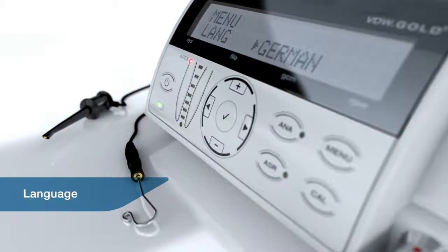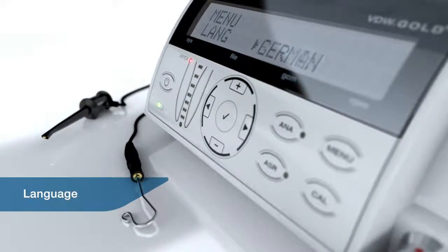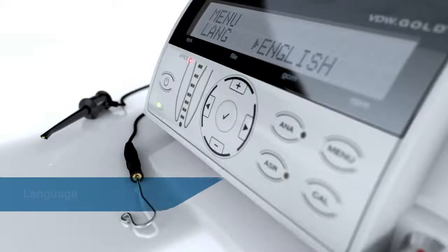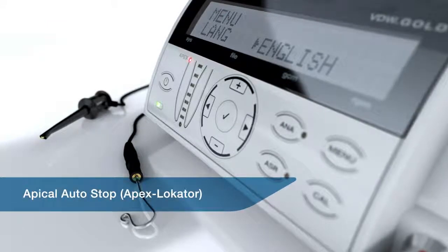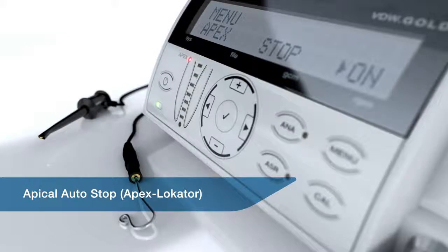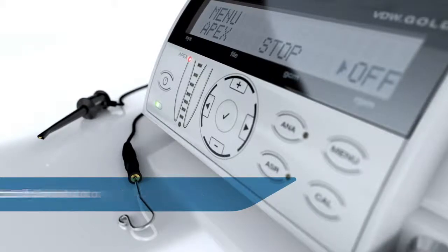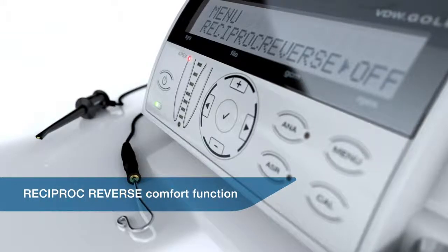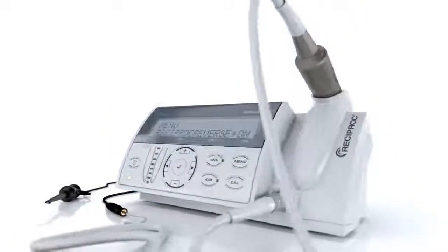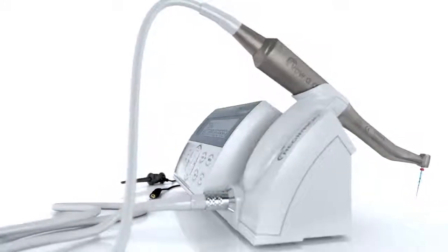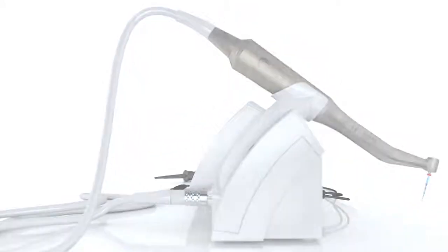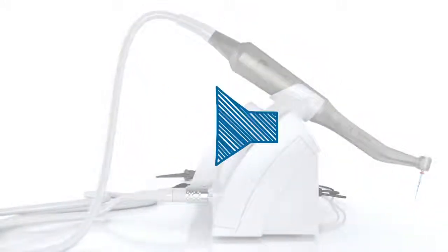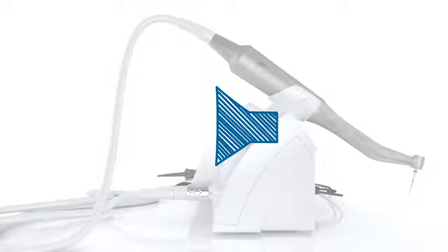You can select either German or English as display languages. The apical auto stop for the apex locator can be activated or deactivated. An additional function is the reciproc reverse comfort function. This two-step indicator gives early feedback in the case of increased friction of the Reciproc Blue instrument. It's especially helpful for new Reciproc users.